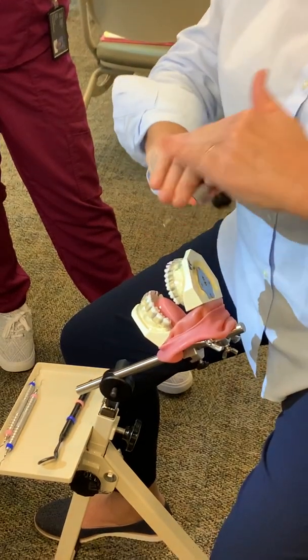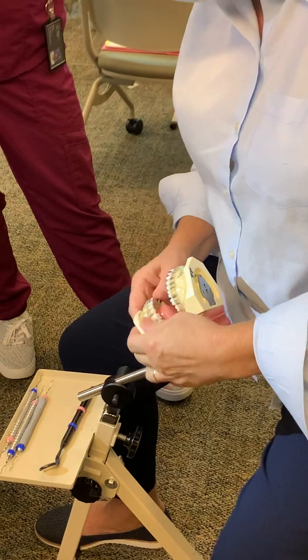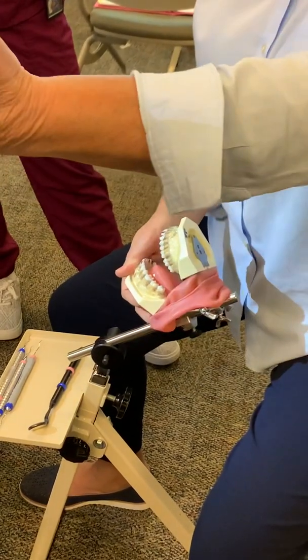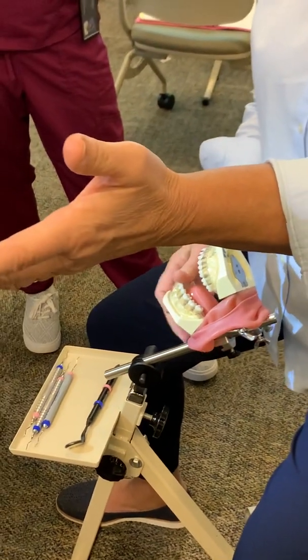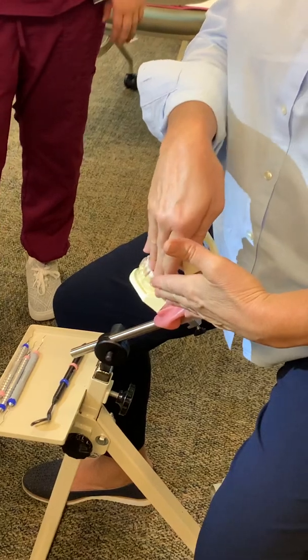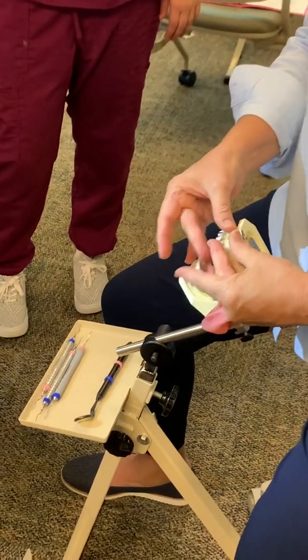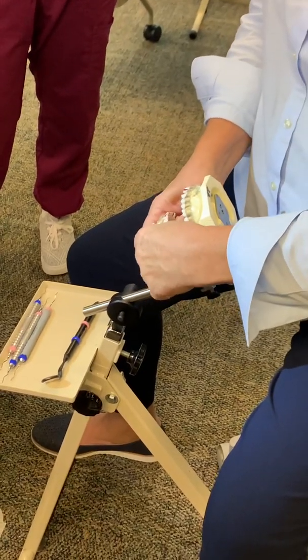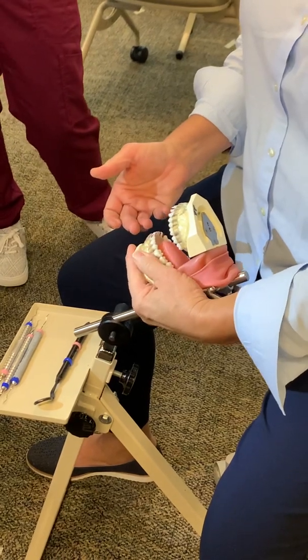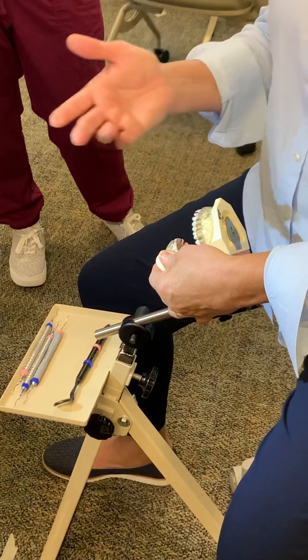If you have really shorter fingers, all right? What we did this morning is we disengaged the mandible, okay? Because Mrs. Ayette, whose fingers are very short, has to have her patient close a bit to get over the face and parallel here. She reduces this opening. So if that's you, you will undo your mandible and then you'll control the movement with your retraction non-dominant hand. So feel free to do that today, right?